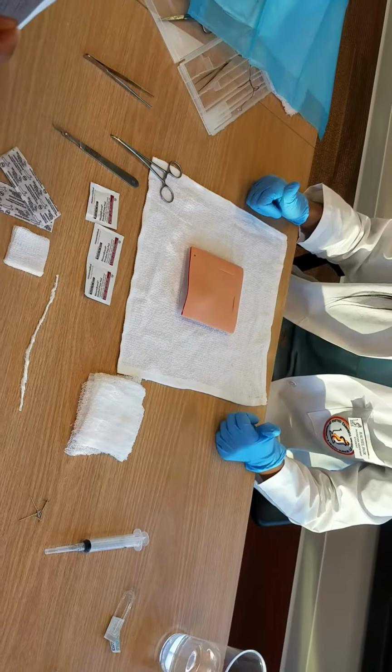Patients with diabetes, debilitating diseases, or compromised immunity should be observed after an I&D of an abscess. Some complications that can occur are cellulitis or recollection of pus. Perianal abscess I&Ds frequently result in a chronic anal fistula, up to 50% of the time in adults. An abscess in the palmar aspect of the hand can extend from superficial to deep tissue via the palmar fascia. So let's get started on this I&D.